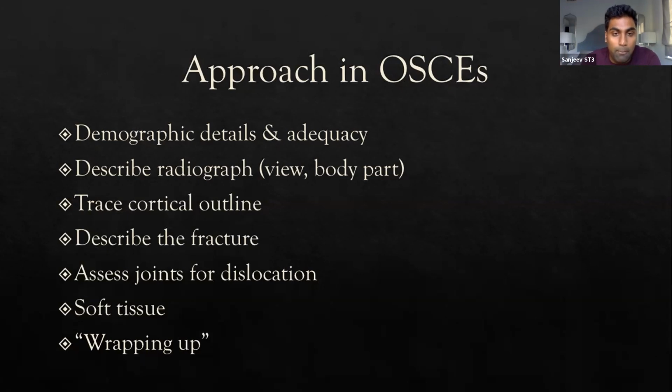That's why it's really important not to neglect the simple stuff like demographic details and checking adequacy. Because at the end of the day, if you see an X-ray and you don't know what the abnormality is, don't panic, go through your systems, seem like you've presented before, seem confident, even if inside you don't feel like it. And then at the end you say, okay, I haven't found an abnormality, but I have got a system and I know how to look at a plain film. And that's the most important thing the examiner looks for.